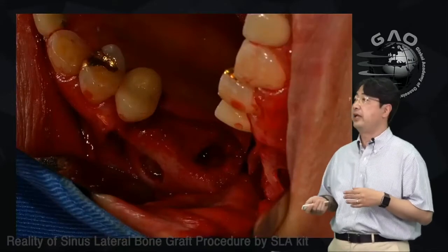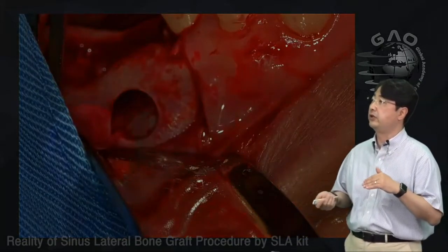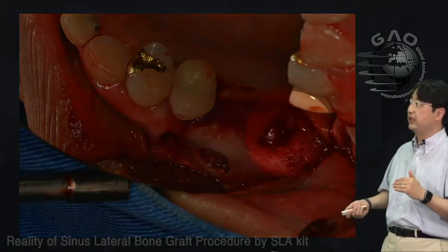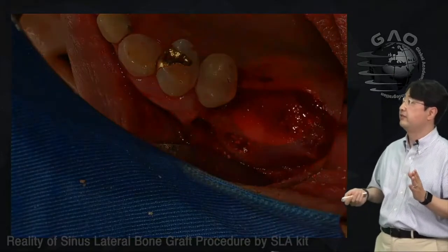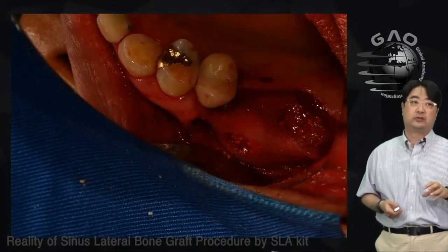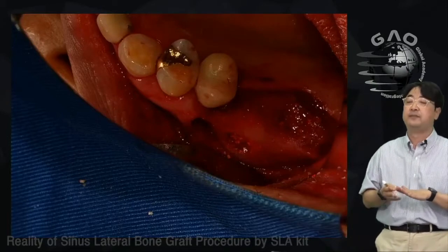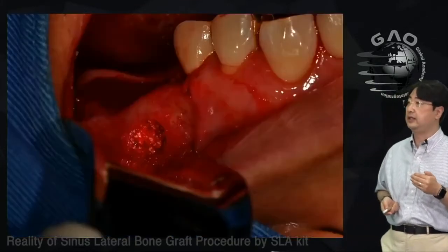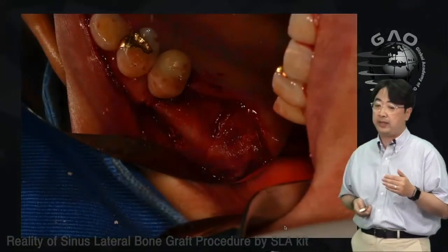I made a window on the area of number 26, dissected the membrane including the tearing part, and placed a collagen tape through the crestal opening at number 27 to cover the tearing. Then I did the bone graft — not from the lateral window but from the crestal approach. The lateral window was used to help dissect the torn membrane. I then filled bone from the crestal opening and covered it with PRF membrane, then closed with sutures.